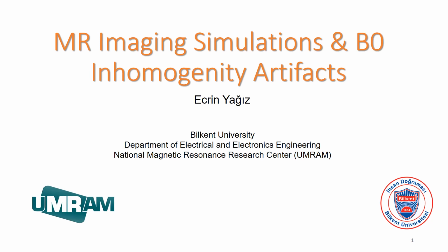In this video, I will talk about my term project for Foundations of Magnetic Resonance Imaging class. My project is to simulate the effects of main magnetic field B0 inhomogeneity. To do so, I implemented MR imaging simulations in MATLAB.